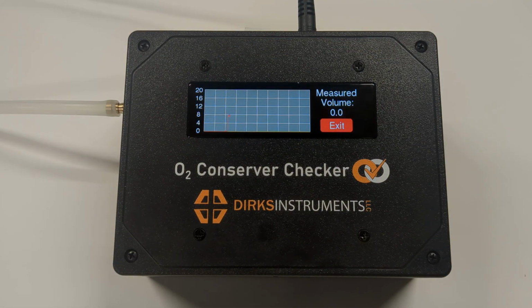This is done by using a syringe with a known volume connected to the inlet port. You can stroke the syringe at various flow rates and verify that the measured volume is within the expected range. The graph will update during the stroke and give you an estimate of the flow rate. At the end of a stroke, it will display the measured volume.